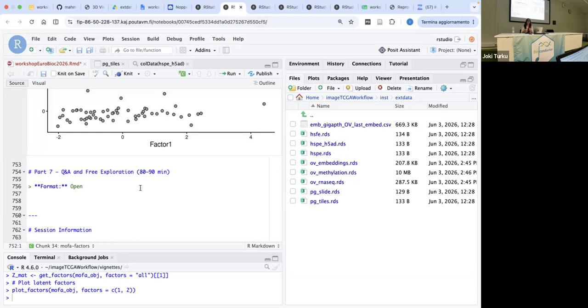For example, embedding 345 doesn't mean something, or maybe it's just a random representation of the data, or maybe a combination of different embeddings gives us more information. Right now these are open questions in histopathological analysis, like digital pathology. Maybe next time we see it, we will have more information about that, but right now there are more open questions.